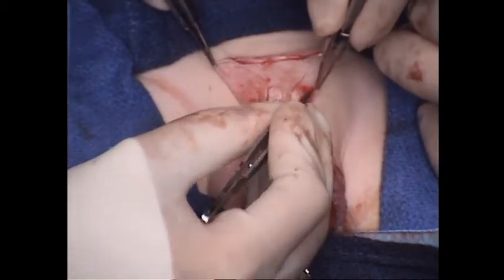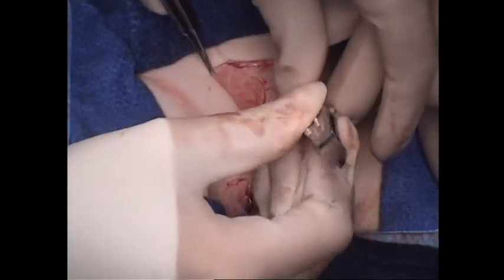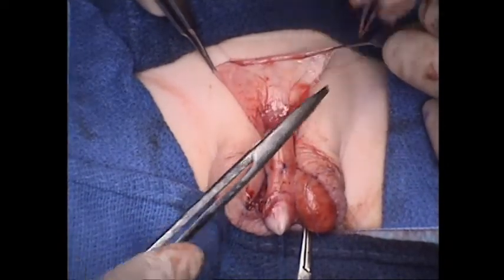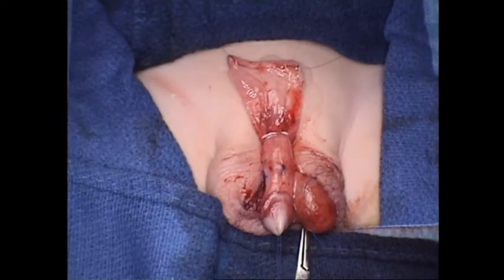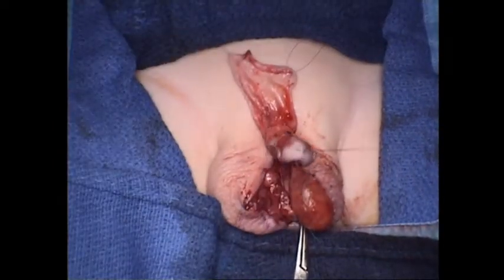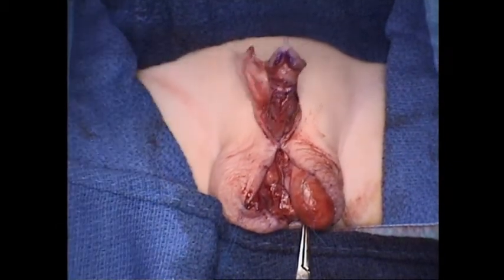What I'm doing now is I'm trying to use the little teeth on my pickups to identify any last little bands of dartos to remove, because we're about ready to size our graft. And sizing our graft is a little bit of a misnomer, because what we're really doing is sizing the penile shaft skin, and everything else is our graft.